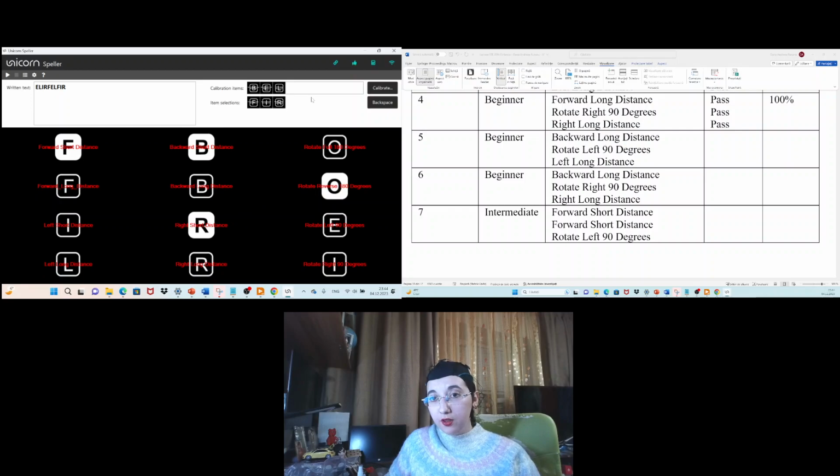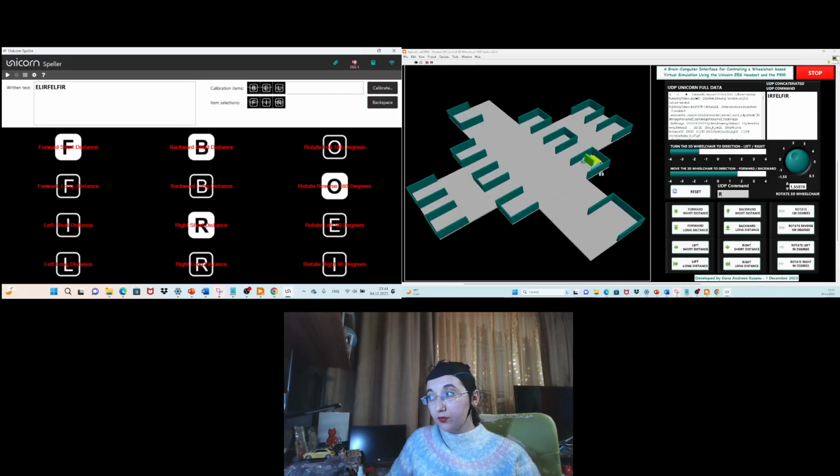So here I check these commands only to compare the expected results with the actual results. So backward long distance, rotate left 90 degrees, and left long distance. So these items are just to remind me which are the letters that I need to focus on. Okay, let's begin.